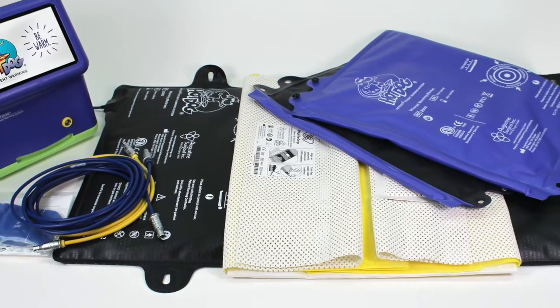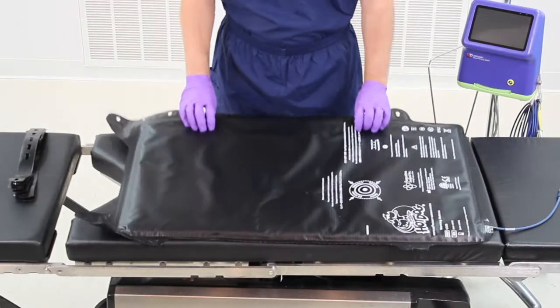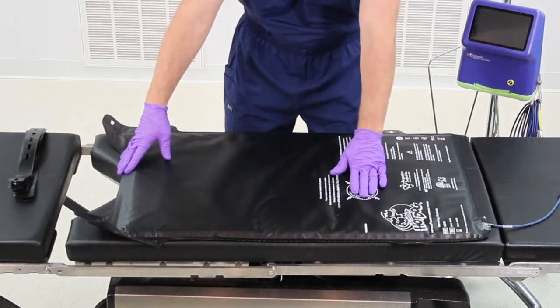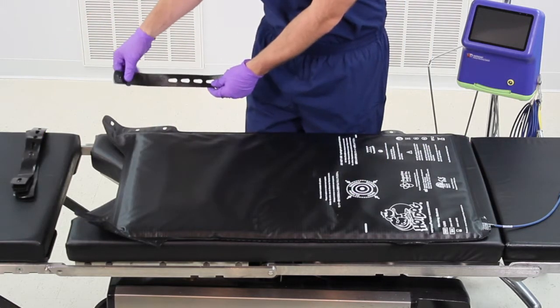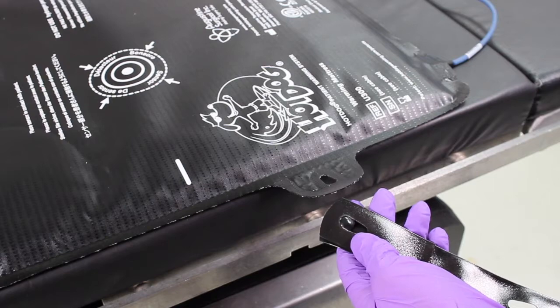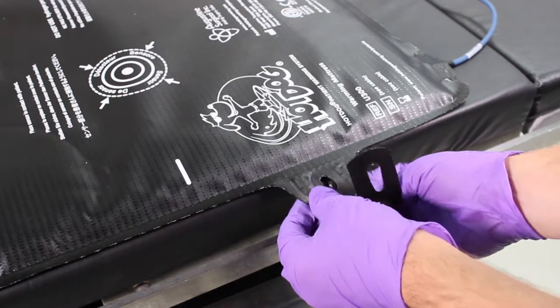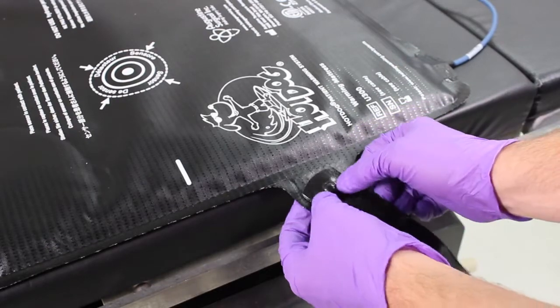Waffle Grip must be used in conjunction with the Hot Dog patient warming system. Place the U300 Hot Dog warming mattress overlay on the operating table pad and align with the perineal cutout of the OR table. Secure the warming mattress to the side rails of the table using 4 to 6 of the durable reusable black straps. Attach the strap to the warming mattress by separating the end flaps and inserting the strap's mushroom button through the loop on the warming mattress.